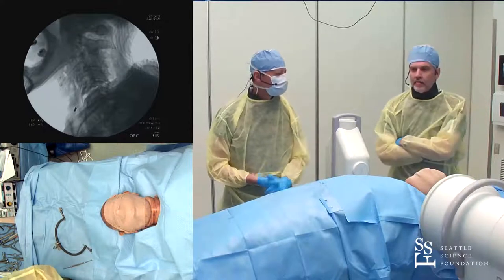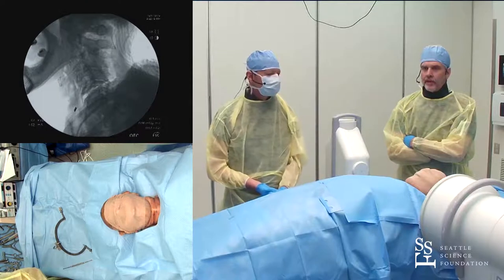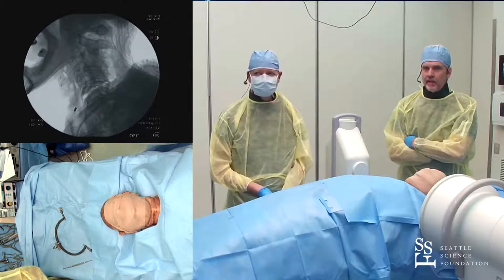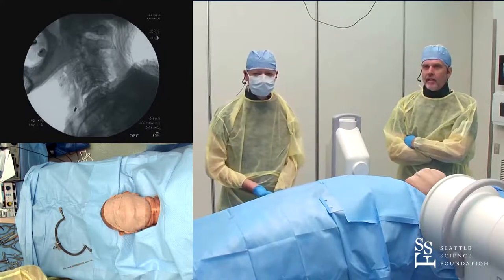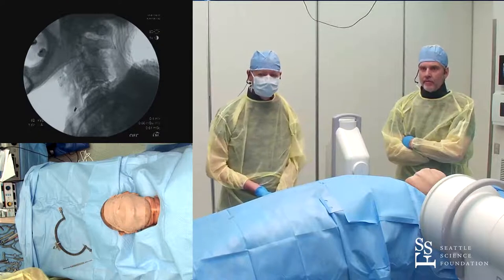I would agree with that. We try to do this as quickly as possible — we'll actually bring the patient to the ICU and do it there. It's much faster than the ER. My personal weight limit has been 120 pounds or two-thirds of body weight. I haven't gone higher than 120 pounds, but technically you can go up to two-thirds of body weight.